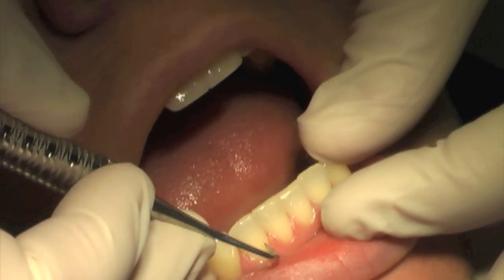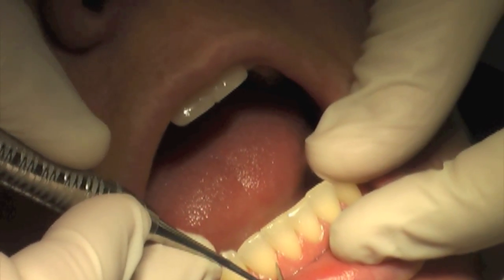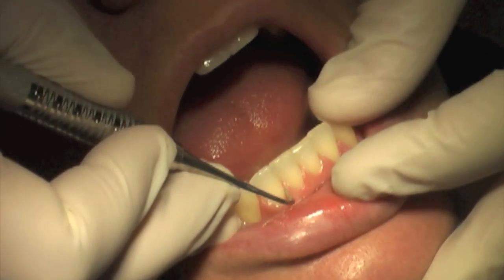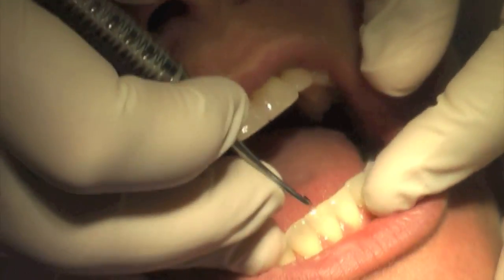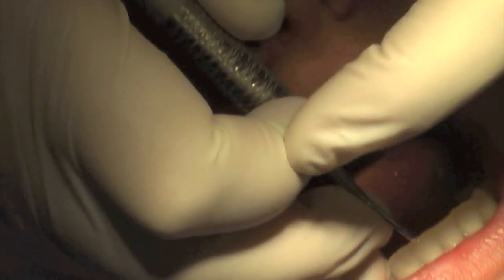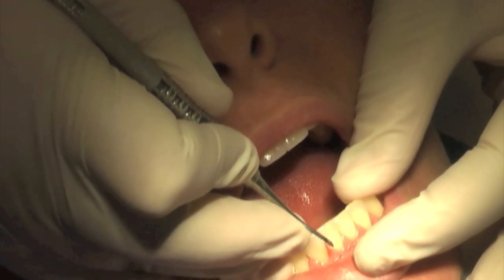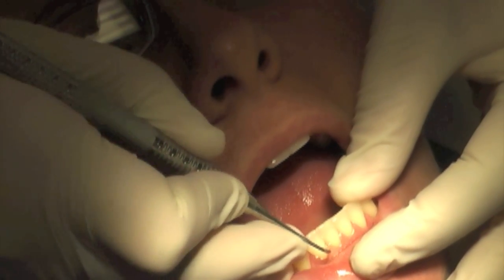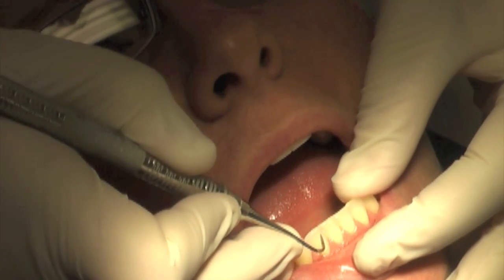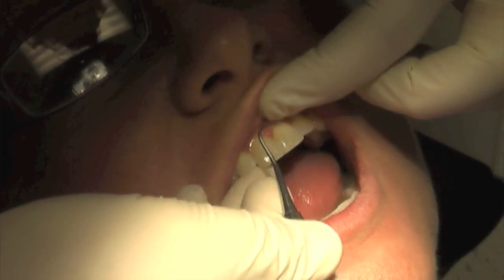Now some people say to me, are you just pointing the toe right at the tooth? I'm not. I'm using just microscopically the tiny bit — the tiny top third of that instrument. That's the thing that's kind of hard to keep in mind. I'm also in the V of the hand grasp here, and I'm staying parallel with the long axis of the tooth. Sometimes I lean it a little bit so I can get the correct blade relationship to the tooth, but on the whole I'm pretty straight up and down.